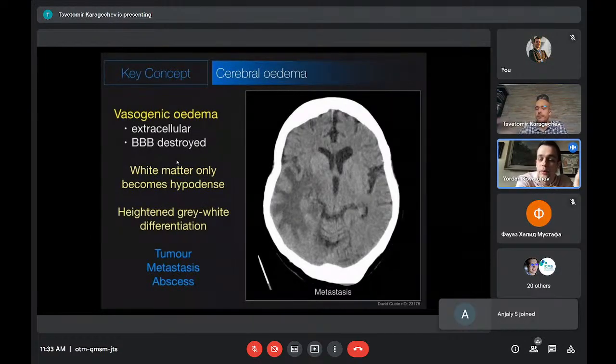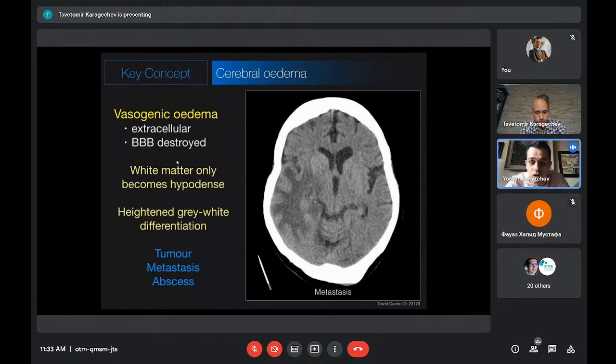It's more rare, but it's an absolute emergency. And you differentiate between the two when the patient has some signs of septic shock, because if there is a brain abscess, then this is really important, immediately to do an MRI, immediately to contact neurosurgery and so on. But I'll show you more common cases that we see every day, which are related to tumor metastasis. And specifically, when we look at an adult brain, the primary tumor would usually be a glioblastoma, and metastasis would be from several different primary tumors, such as breast cancer, renal cancer, and so on.